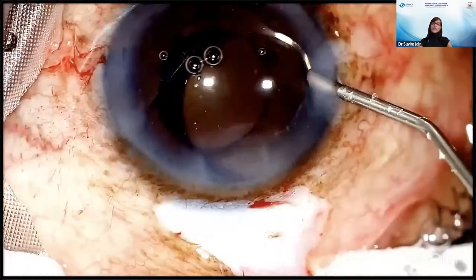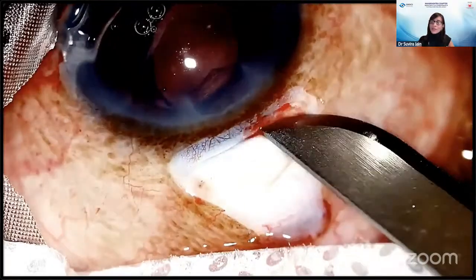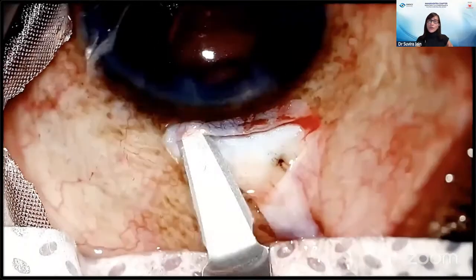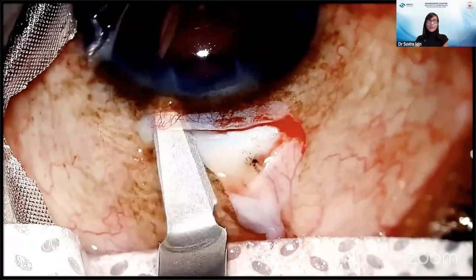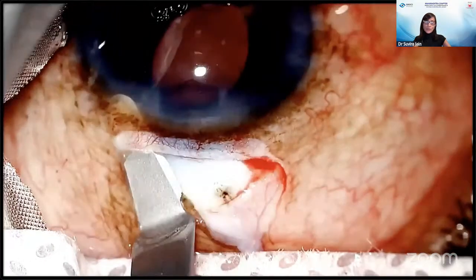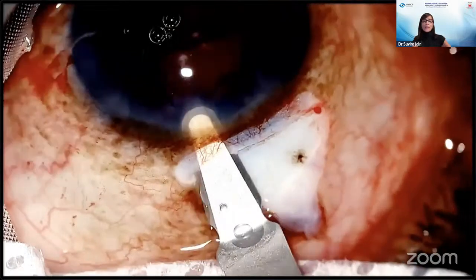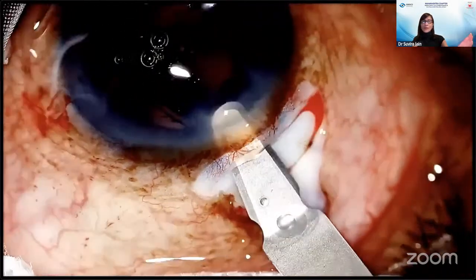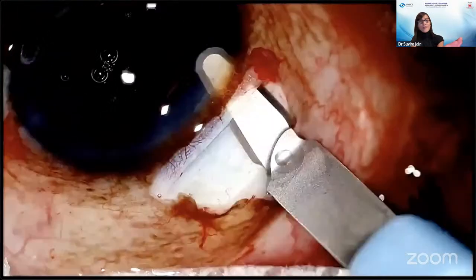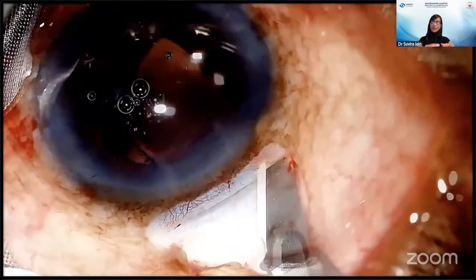Now, obviously, you want to just remove a foldable IOL, so you don't need a very large tunnel. I'd like you to notice how this surgeon actually joins the two tunnels together most elegantly. It's not my preferred technique of choice, but it's his, and it's worth demonstrating. So he starts at the same clock hour, because that's his preferred position of ergonomic ease, both for phaco and SICS. But while he dissects the tunnel out and moves from the left end all the way up to the area of the phaco tunnel, notice how he blends it into the phaco tunnel. And having done so, now navigates, finds his way to the other end of the phaco tunnel, and then extends the tunnel further into the cornea and then into the sclera, very elegantly joining both the phaco and the SICS tunnel.